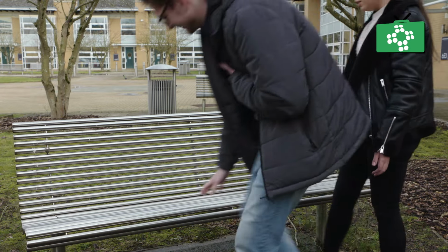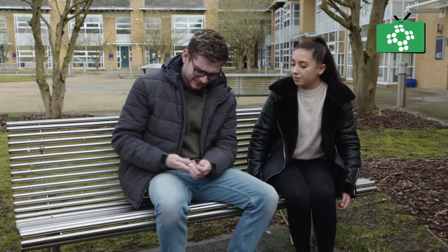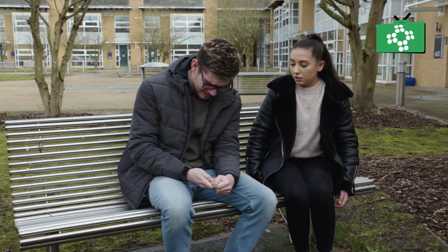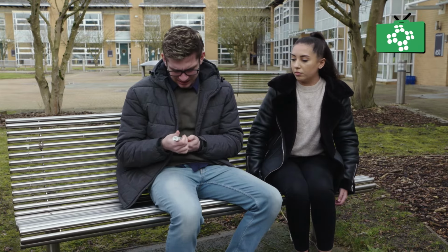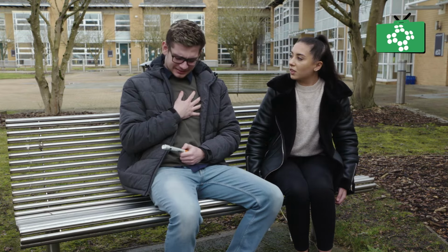When using an EpiPen, you should first remove it from its case. Then sit the patient down, or if they're feeling dizzy, lay them down. Remove the safety cap and gently push the auto-injector into the thigh. This can be done through clothing, but make sure that the needle doesn't go through any thick seams in the clothing or anything that's in their pockets.